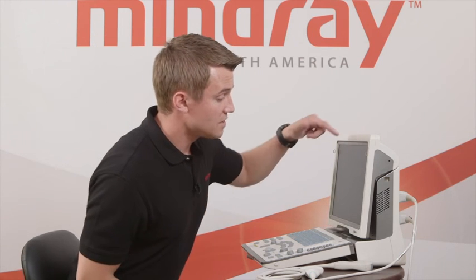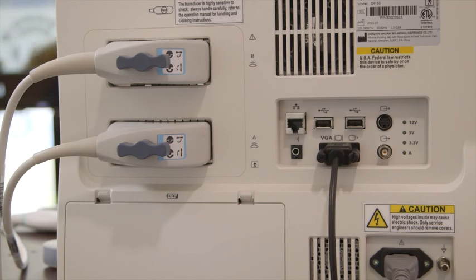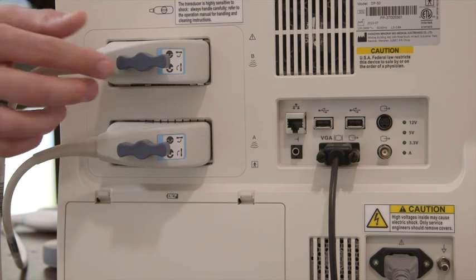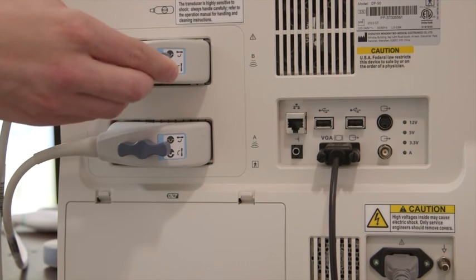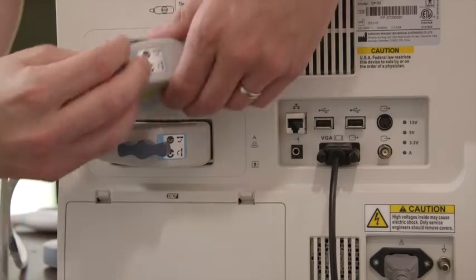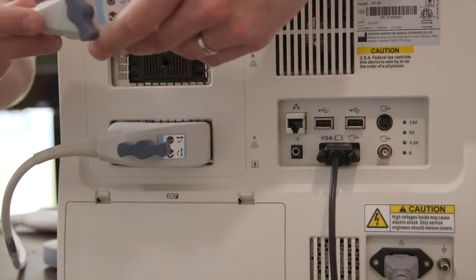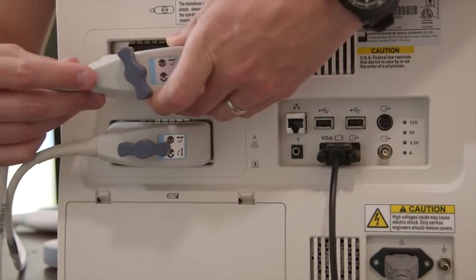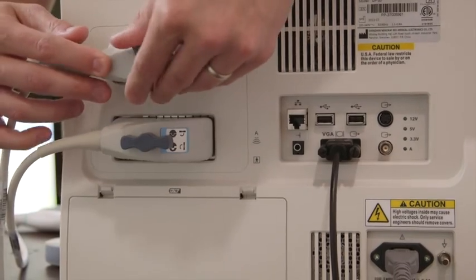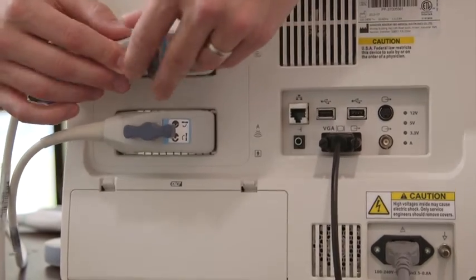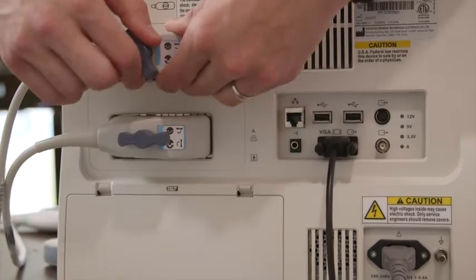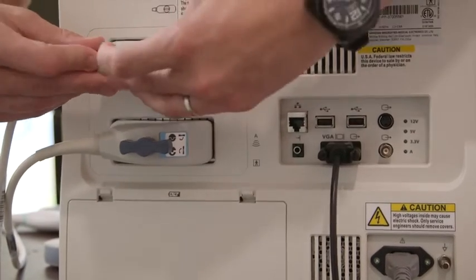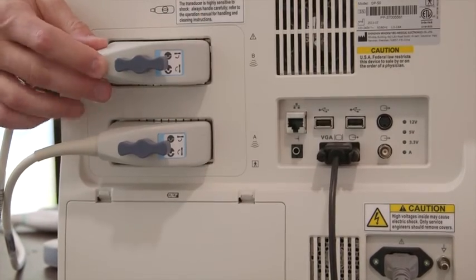As we look to the back of the machine, we'll see where the transducers connect, and we want to do that before we power on the machine. As we look at it, we see that there's a little twist knob here. We can take it out, and that's how you'll find it as you take it out of the box. There's two ports in the back of the machine, and they just twist and turn and lock into place.